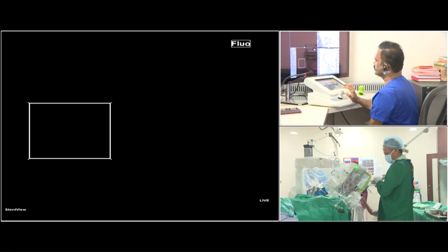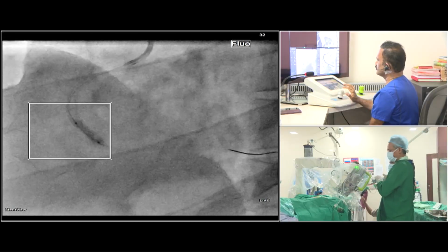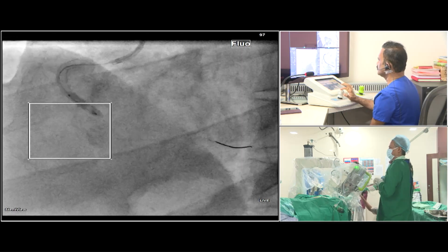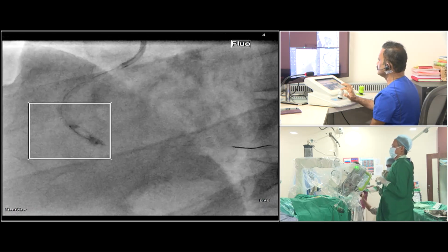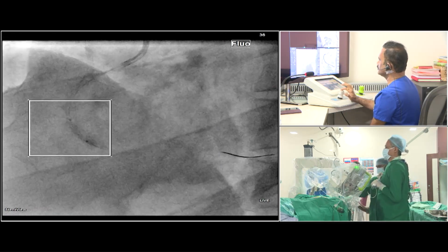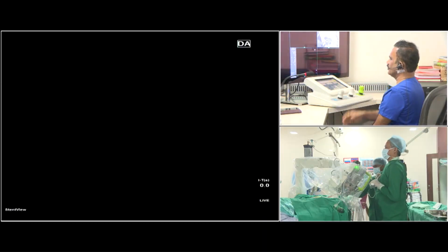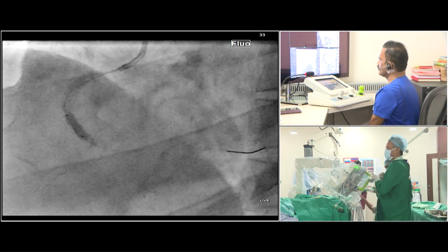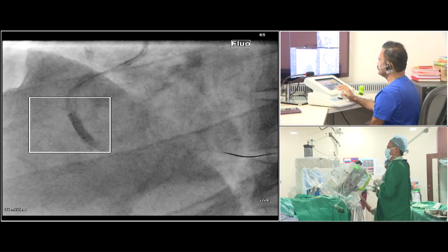So going up again. So I'm going up to 12, okay. 14, okay. I'm taking it back. Yeah, go 18. So I'm going up. So up to 12, 14, 16. It's 18 now. Okay. So I'm deflating now.